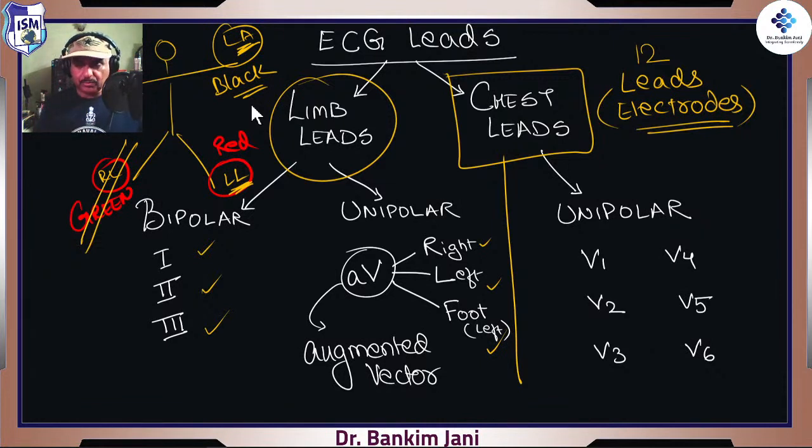How are they done? There is a computer associated with it, a chip which calculates and interpolates, and everything is displayed. If you understand that, it is like wanting to become a formula car racer: if you know your engine well, you'll be a master of driving. In the same way, if you think about how the computer generates all those graphs, your diagnosis becomes much easier, almost like mathematics. Trust me, after 15 minutes you will be able to look at the ECG and say this is a heart in normal position, this is right axis deviation, this is left axis deviation.